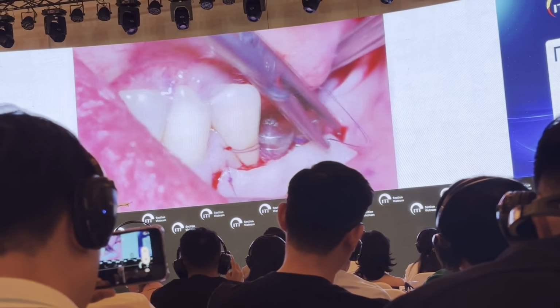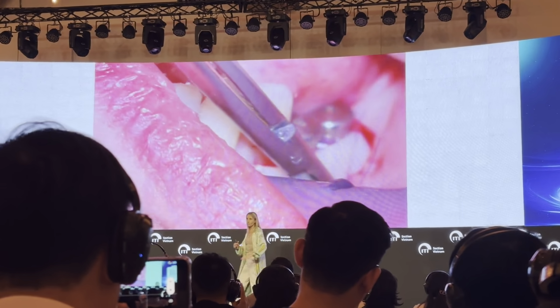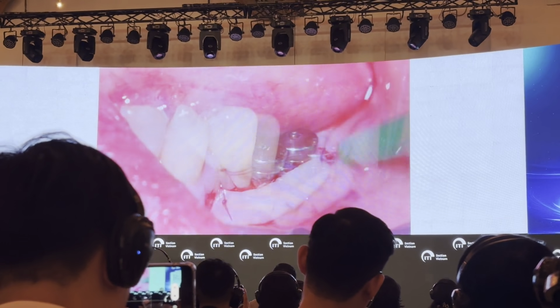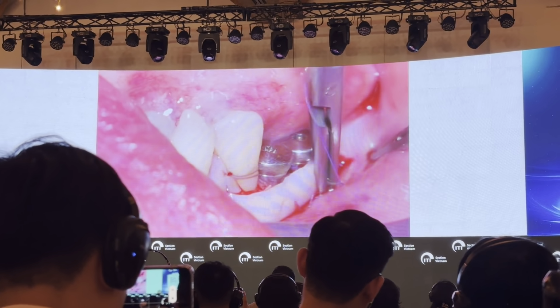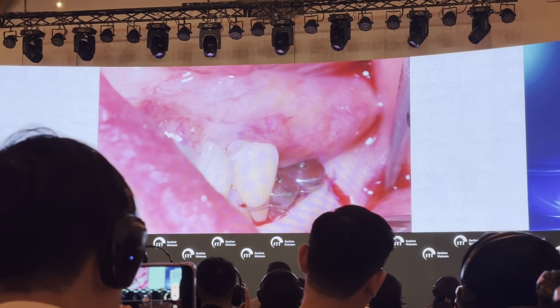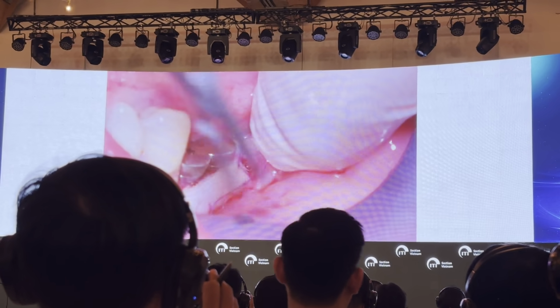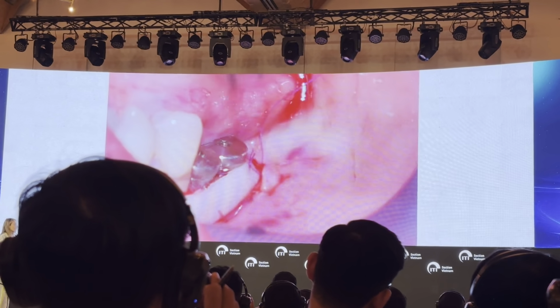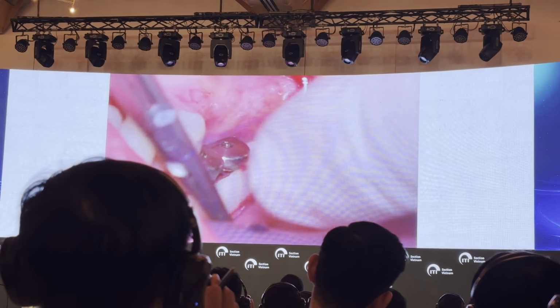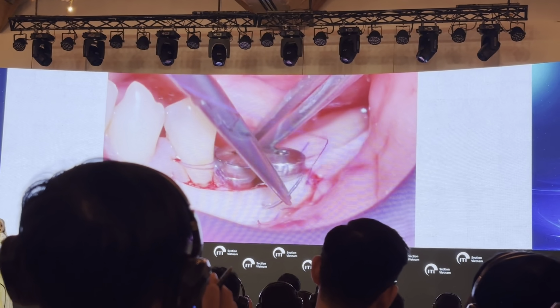Because the same thing is going to be performed on the distal aspect. This is a coronal single interrupted suture, but then I'm going to stretch toward the distal side, the distal apical angle, with this horizontal incomplete external mattress suture. So you can see graft perforation, the needle comes out in the attaching tissue, and then I come back from outside toward the graft without perforating the graft, but you see that when I pull the suture, the graft is stretched toward the distal aspect.